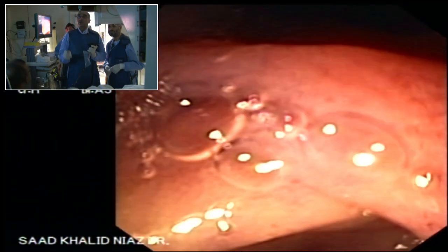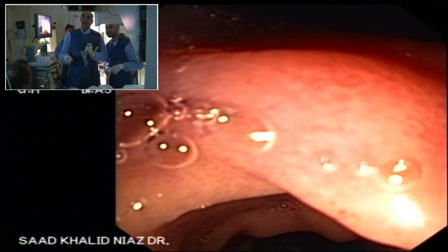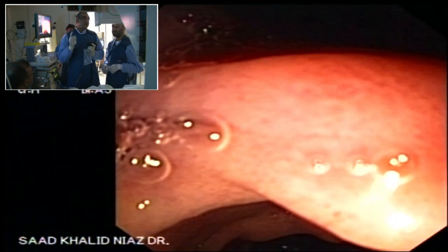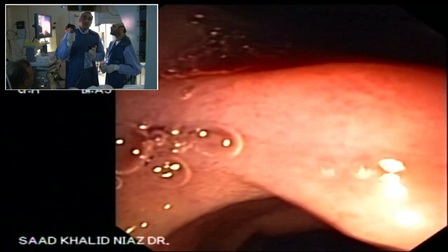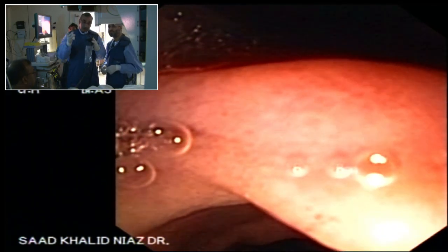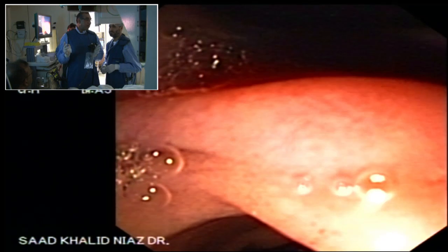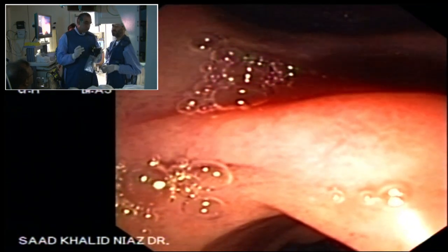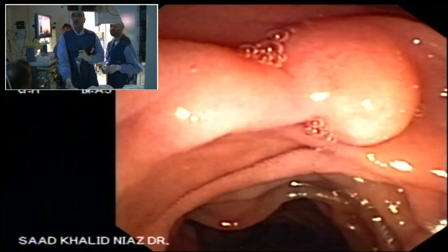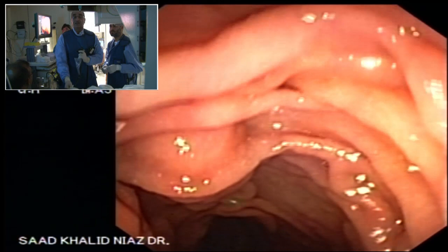Right, okay? So you go into the duodenum, it makes it so much easier. Don't push or do any torque steering here. Torque steering is for colonoscopy, not for ERCP, right? So look, my scope is straight, I am not twisted in any posture, I am comfortable, I am relaxed, and I am talking to you, right? The scope is not twisted or anything. We are in the second part of the duodenum now, right? You can visualize the papilla there, right?